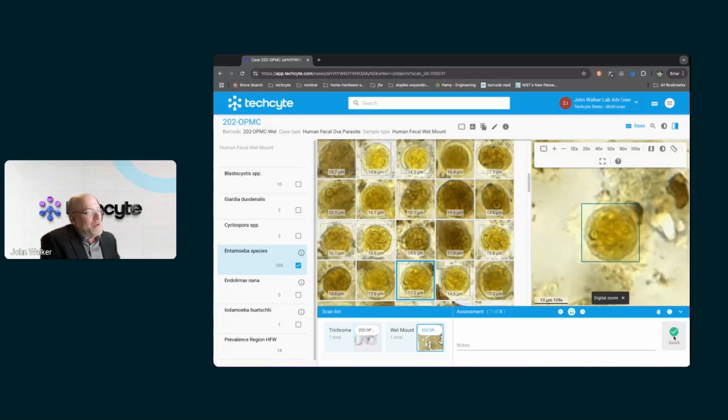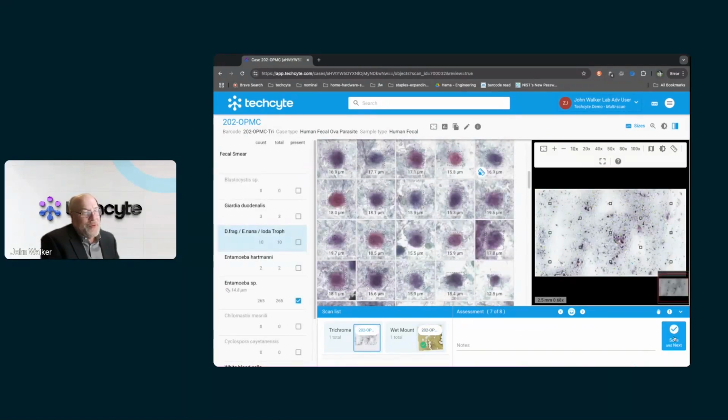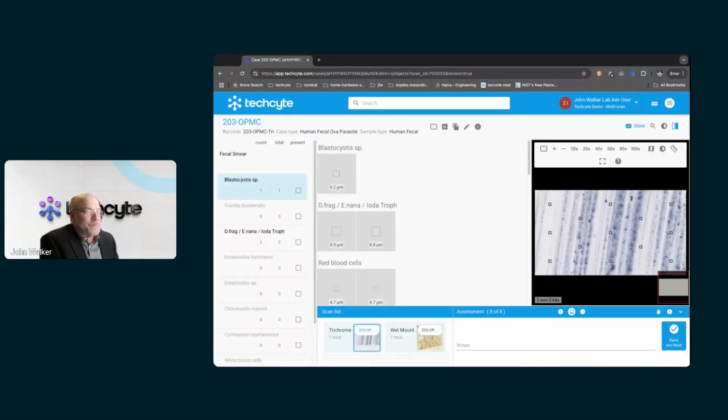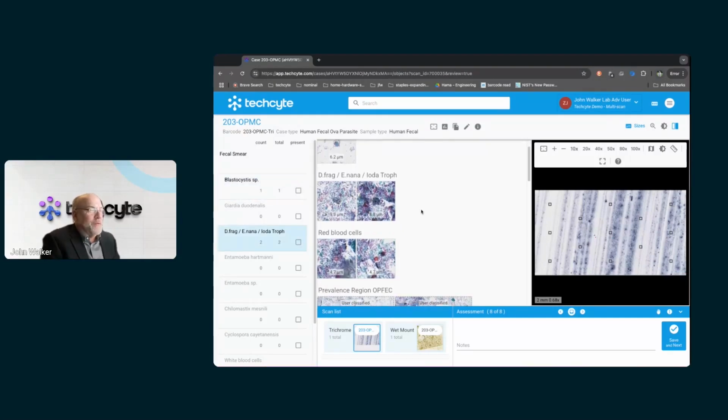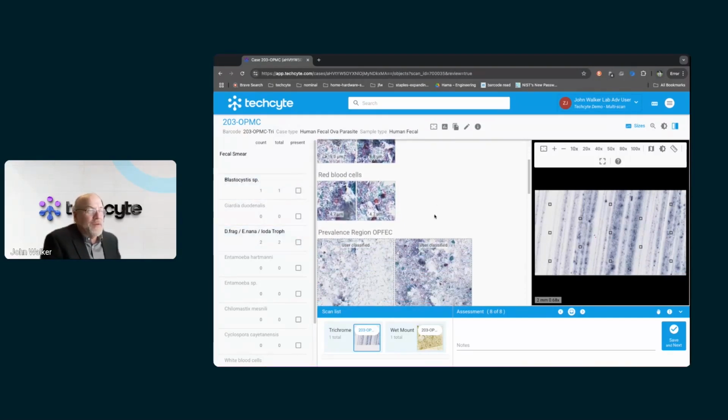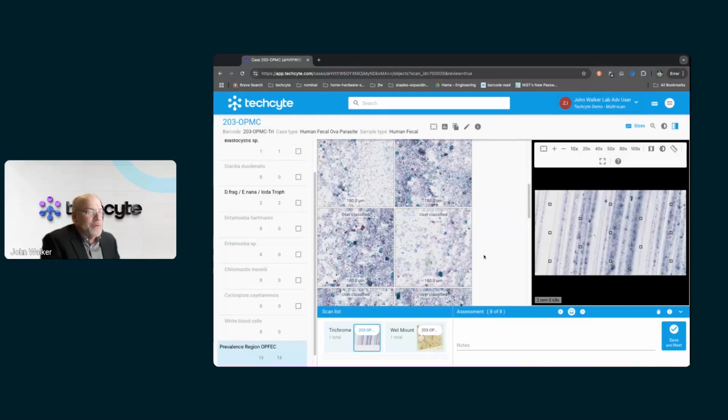Just like last time, I forgot to save the trichrome, and so it'll take me back to it. I already know my answer. I've already confirmed entamoeba. And so we're on to the next one. If you have a situation where there are no protozoans, then you would expect, as I see here, that the trichrome is negative. There's nothing to see to confirm there.